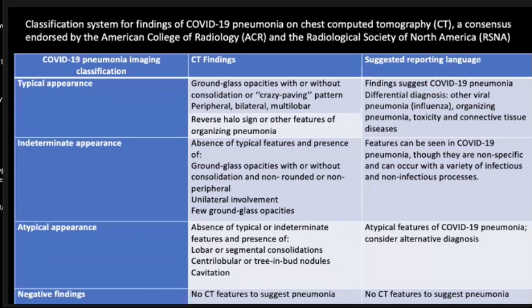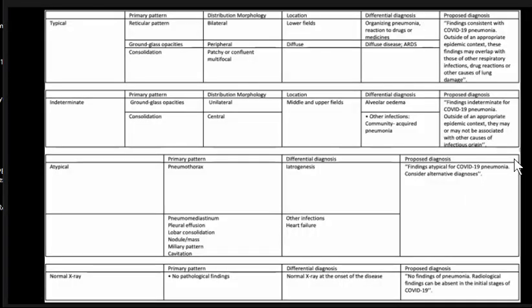Could you go back to the table, yung table for the X-ray? Okay. Because sa nababasa ko sa chest CT, maganda interpretation natin. We're really guiding the clinician na, oh, this is COVID, this is typical for COVID. But for X-ray, medyo nagkakaiba-iba tayo. So, para man lang dyan, unified tayo, Dr. Arches, Dr. Mike Corsino, ako, Doc Jet. Hindi lang isa ang gumagamit ng proposed diagnosis.